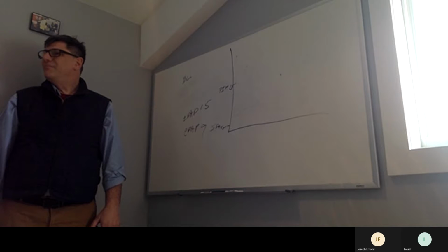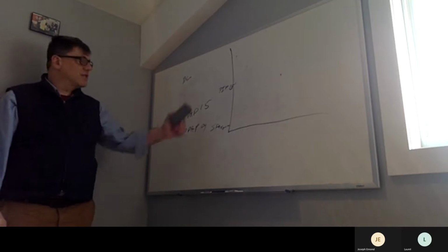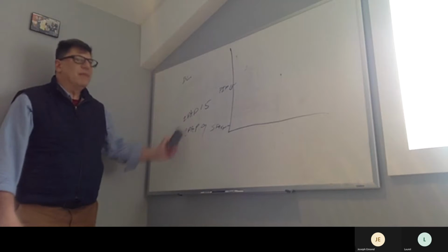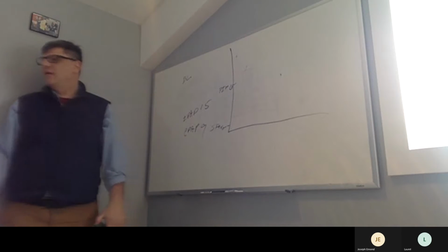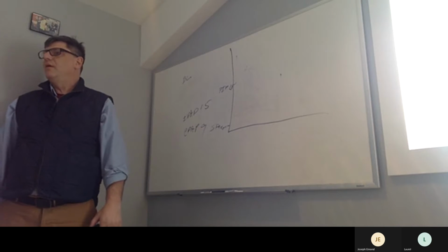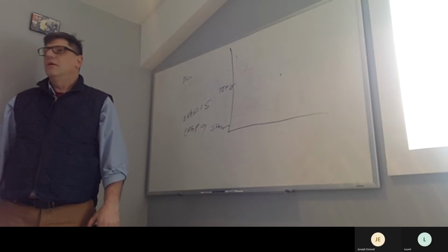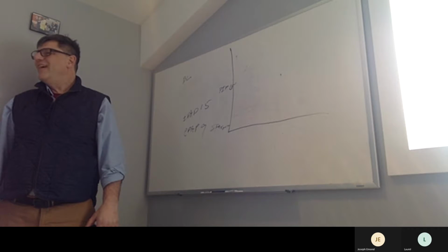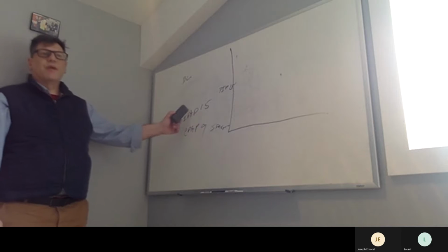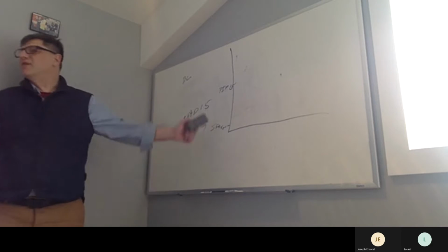Another way to cheat is, what is pressure married to? Volume. If I have enough spread between my IPAP and EPAP, even though my volume is low, I can spread those or make them bigger and my volume gets up. So how much do I weigh? 100 kilos. How much should I weigh? For an ideal body weight, my total volume is around 350 to 390. So with the appropriate spread of IPAP and EPAP, my tidal volume should be my expected tidal volume from the height.